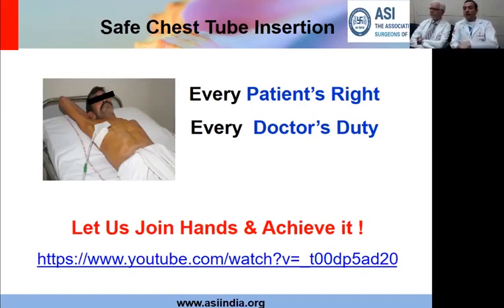And if it's going inside, then of course it's coming out in the chest tube. You won't be able to know whether it's actually an intercostal bleed or a lung bleed or which bleed. Then the patient will probably merit an exploration.